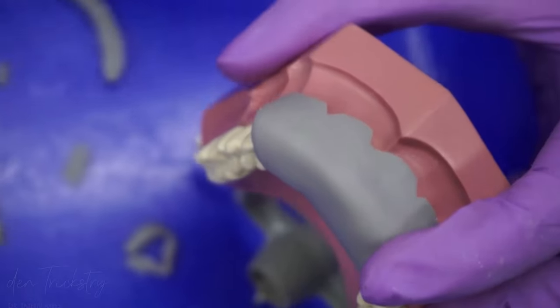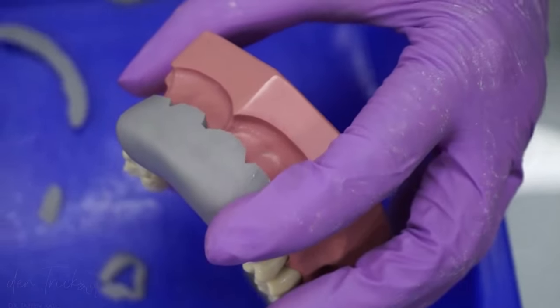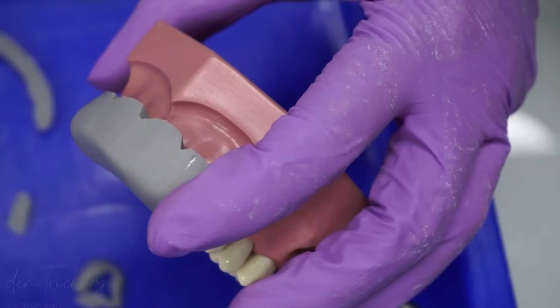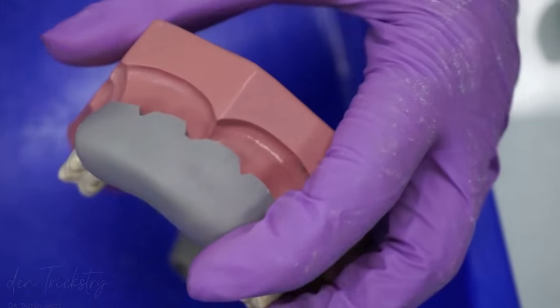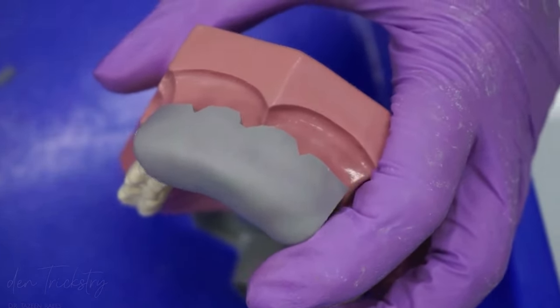The next thing to do is to have a reference mark so that whenever you place the index on the teeth, it will be positioned correctly. In this case, the labial frenum is my reference.